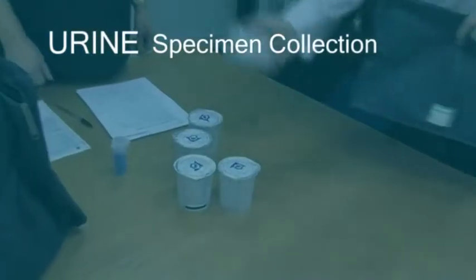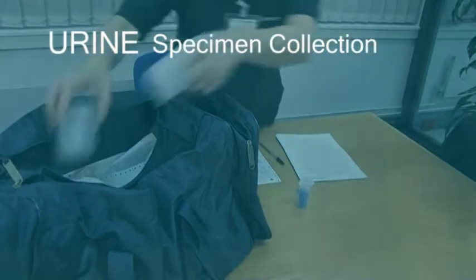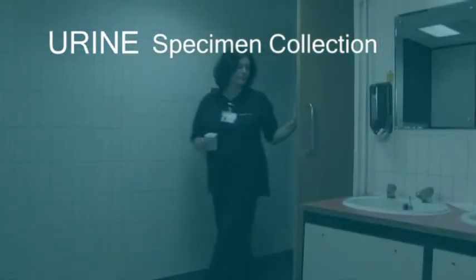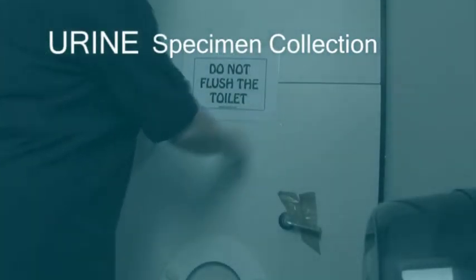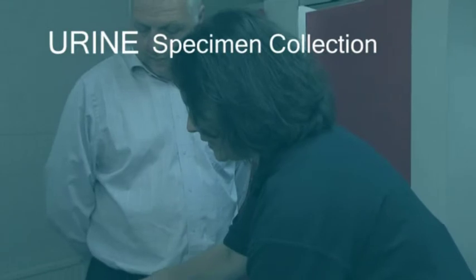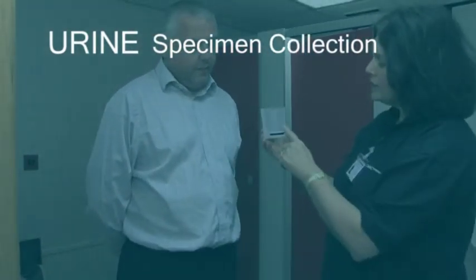Invite the donor to select a collection kit and remove the others from your collection area. Taking the chosen collection cup and bottles, go with the donor to the cubicle. Check that the colouring agent added earlier to the toilet bowl is still present, and do a final quick check that nothing has disturbed your earlier preparations. Making sure that you are watched by the donor, tip out the contents. Indicate the amount of urine needed.